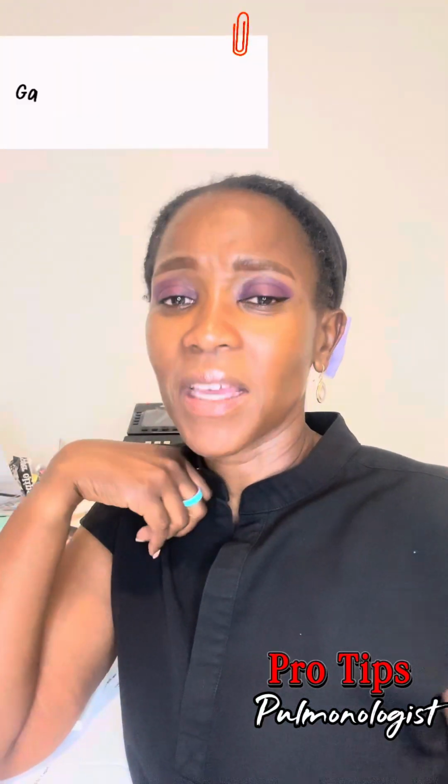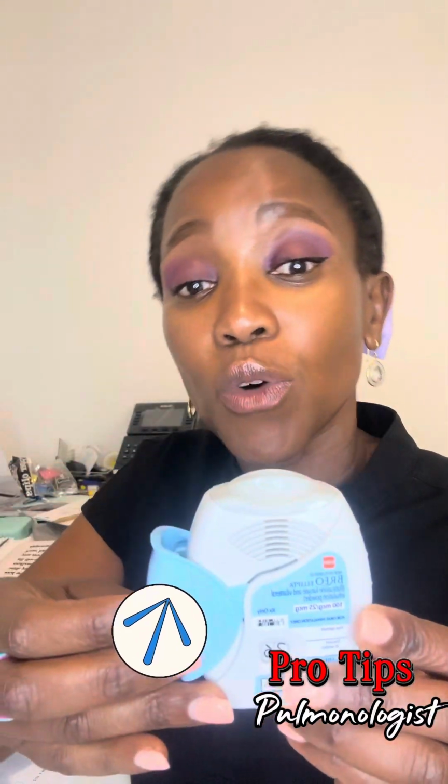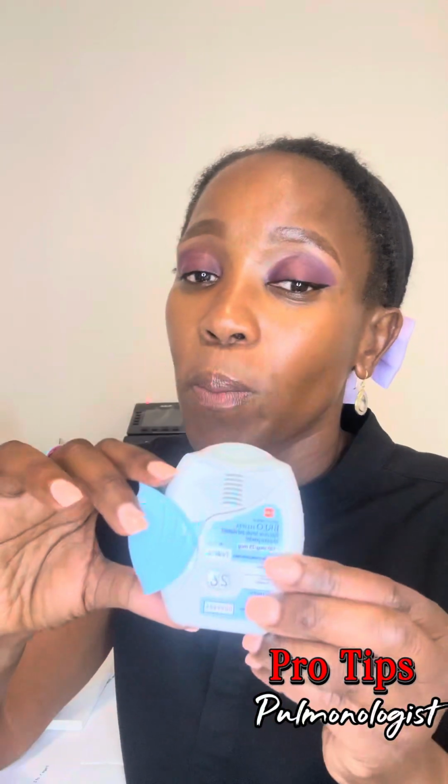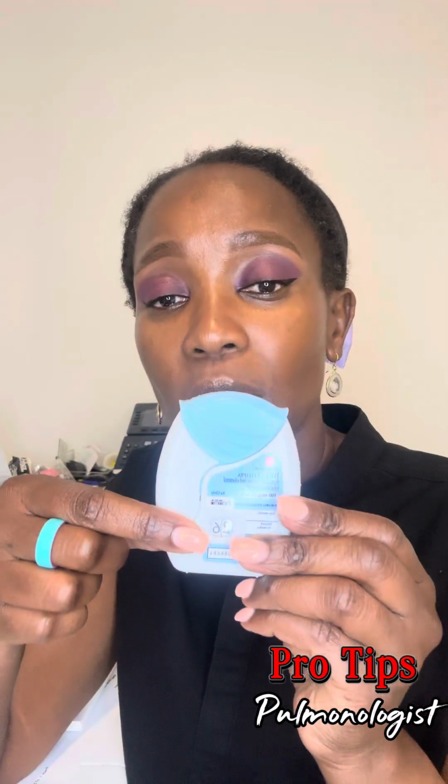You may taste something. You've got to rinse your mouth after, down by one, and you will close it if you're done. If you were unsure if you got everything before you close it, you can do it again, as long as you only opened it once. The number should not move, but once you close it, it's now going to reopen and give you a brand new number, which is what's being dispensed for you to use for that moment. Don't open and close. You will waste this one.